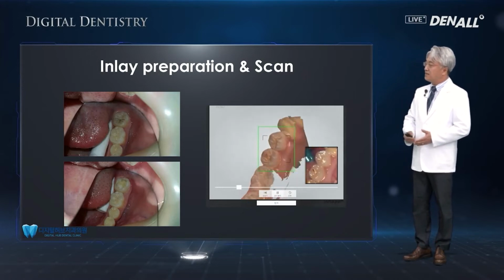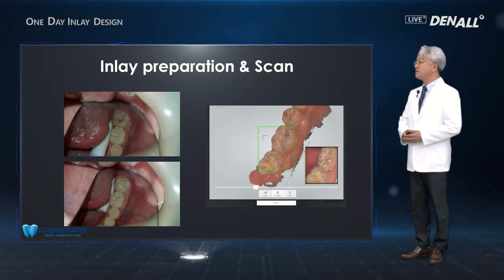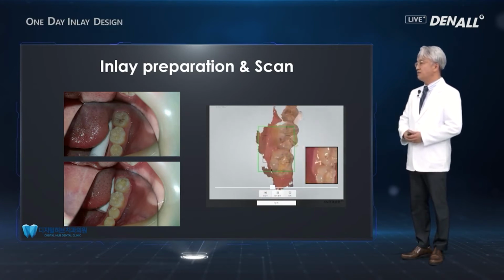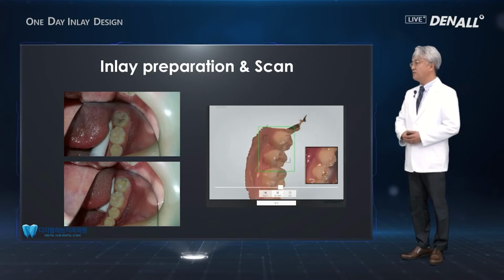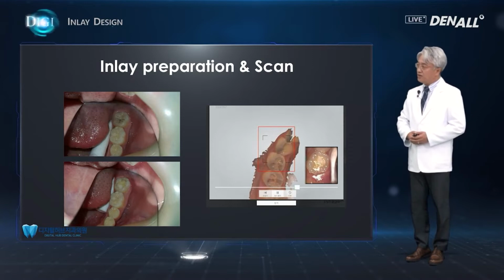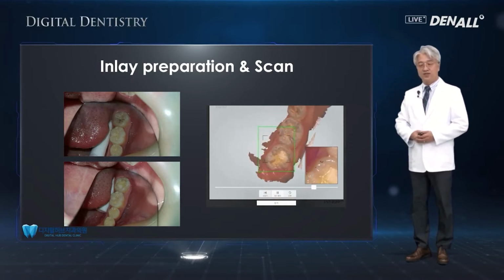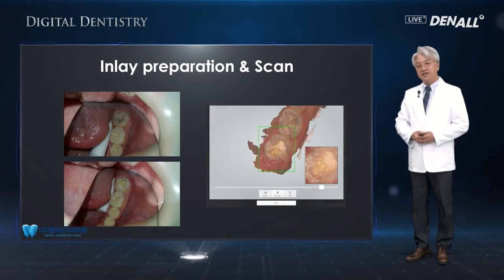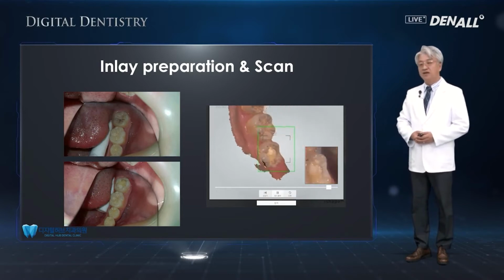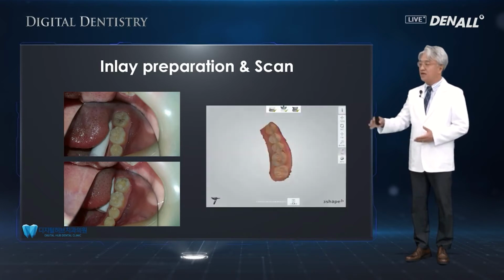Actually, the patient was scanned with TO3 without much problem. The scanning was done quickly. Inlay scan, especially one-day inlay, is the topic of this lecture because when it comes to crown, bridge, or denture, cord packing or other steps, there are challenges while scanning.